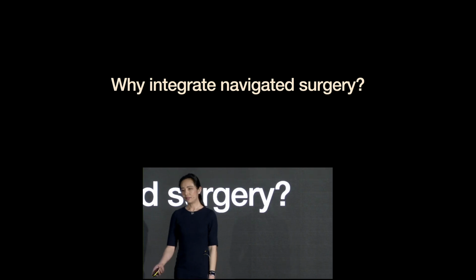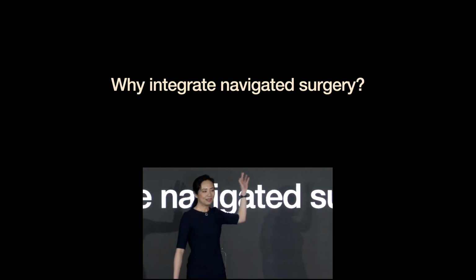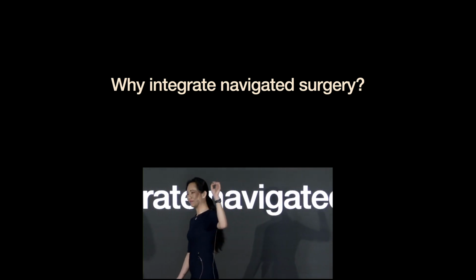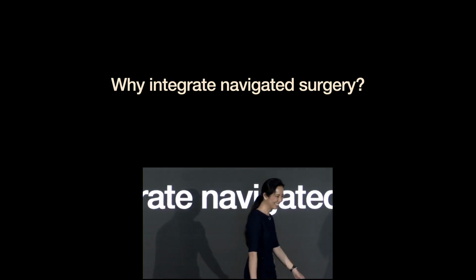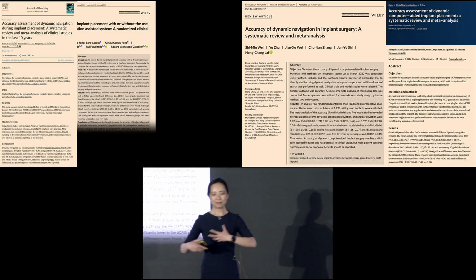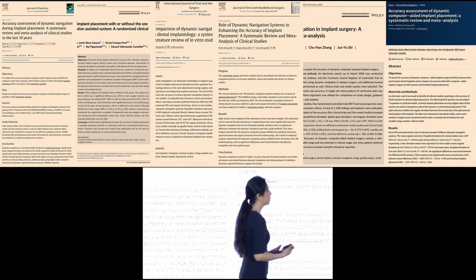So why integrate navigated surgery? How many of you have full faith in freehand surgery 100% of the time? Like every single time, the implant goes exactly where you can imagine it wanting to go. There are some surgeons out there who need a little help because for whatever reason, it might be the surgical setup, it might be they're new to an office, or they want better control.